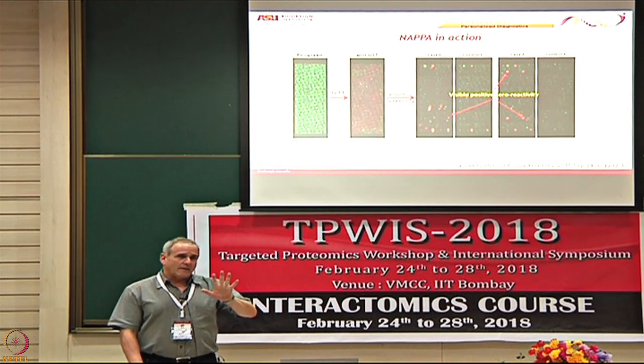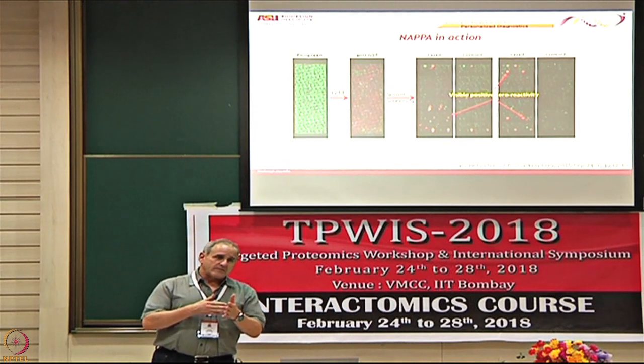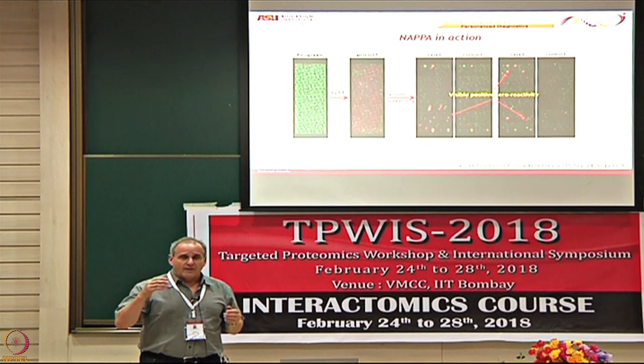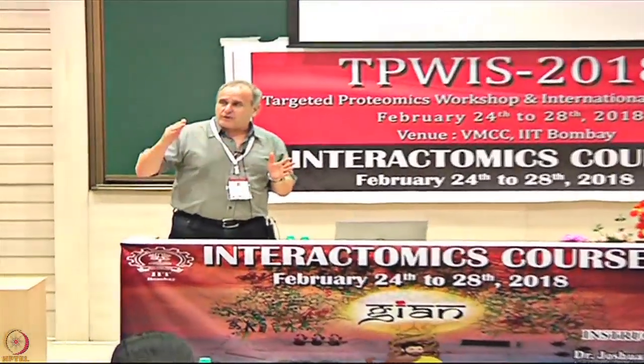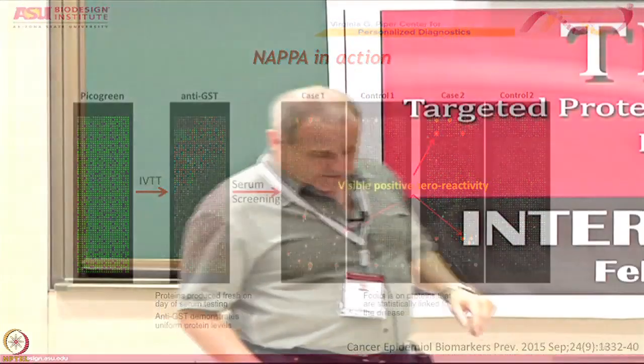What we do is we get a numerical readout of signal intensity, and then the software adjusts the image, and the color that it represents tells you what level of intensity that equals. If we were to do just grayscale intensity, then we would have pretty much only a tenfold range. By doing different colors, we can cover a larger range. And so typically blue is weak, green is stronger, orange is stronger than that, yellow is stronger than that, and red is the strongest.